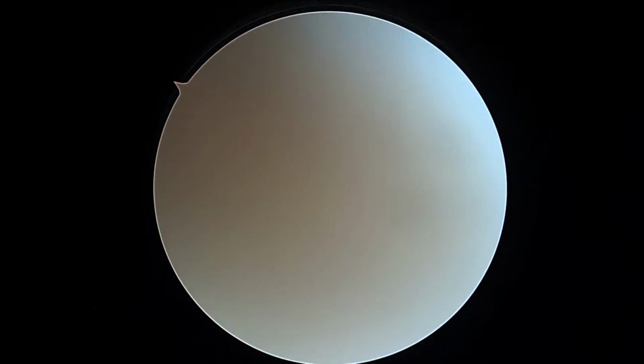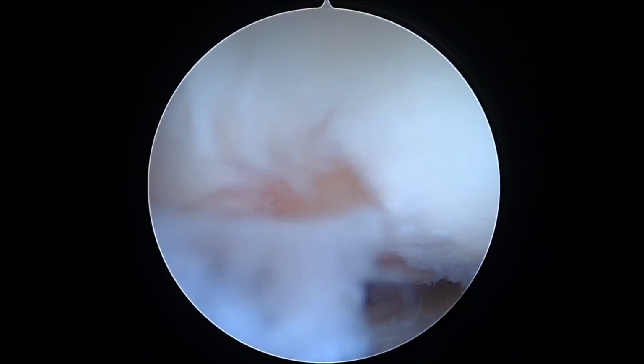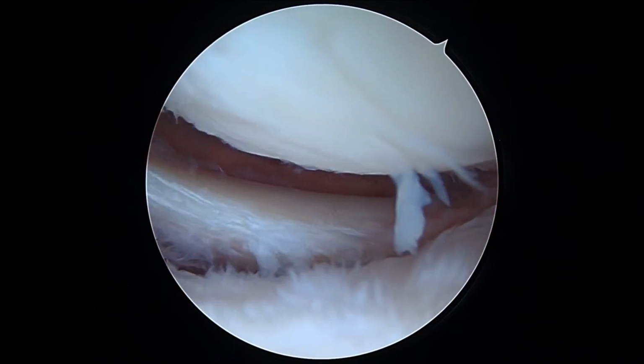So the bottom line, though, is the articular surfaces look great every place but the lateral compartment, which has a lot of arthritis in it. So as we sneak back over here to the lateral side, you can see these areas here that we're dealing with. So I'm going to work a little bit more. We'll come back up on the video one last time before we go.